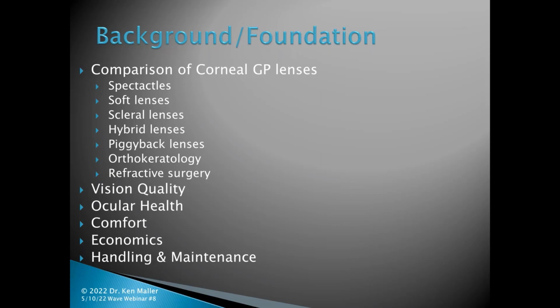And as far as handling and maintenance, the handling absolutely is much easier with a GP lens than virtually everything on here except the spectacles. And as far as the maintenance, once again, except I might concede the daily disposable soft lens, which has no maintenance, everything else on here requires a bit more maintenance than a corneal GP lens.